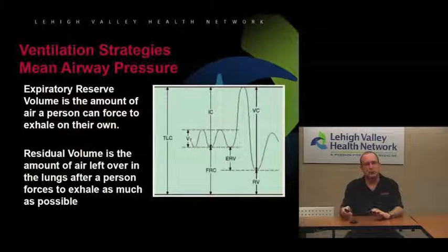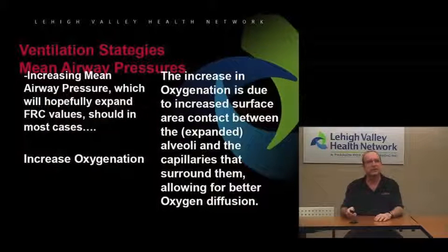And that's actually where your oxygenation happens. A lot of people think you get oxygenation from squeezing the bag faster, and that's sometimes the case, especially if you went too long in your intubation attempt. But really, oxygenation happens after the person has exhaled, as pressure holds the alveoli up against the capillaries. So when we increase our mean airway pressure, we're actually expanding our FRC values, which in turn increases your oxygenation.